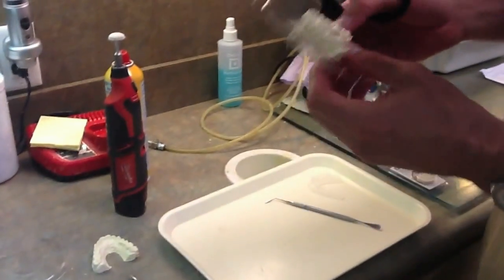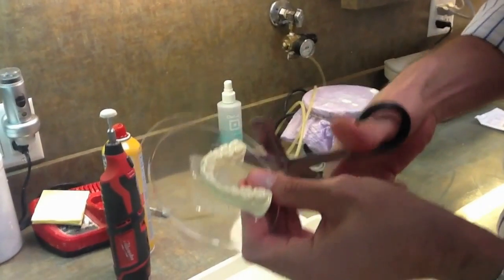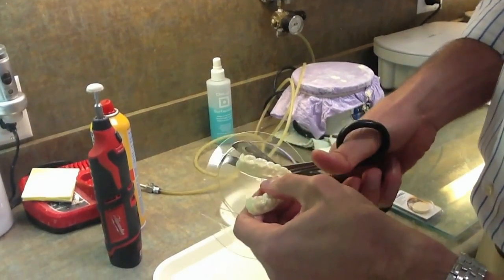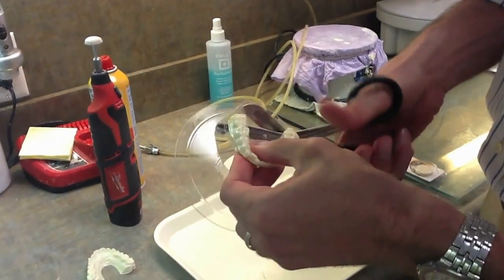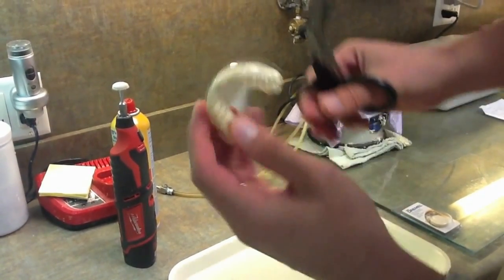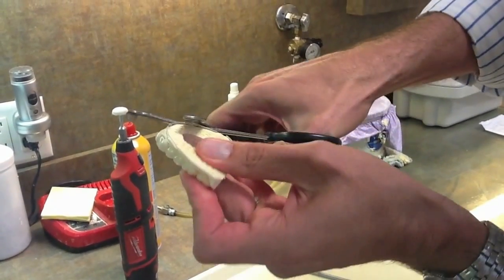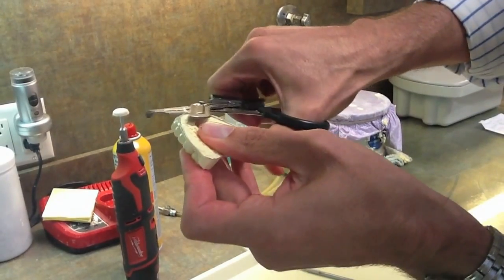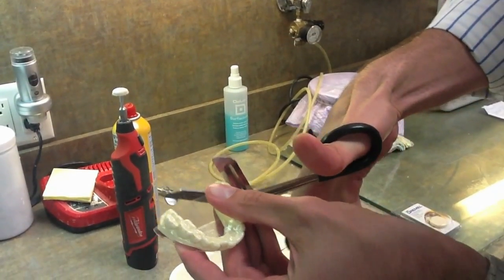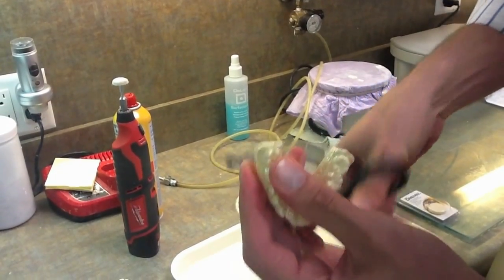Now I'm going to do a lower model to demonstrate that sometimes the tray will get blocked or sucked into an undercut. We follow the same procedure — cut around the periphery, make one vertical cut, then trim the undercut away from the model with the scissors to help unlock it. Make sure to cut off the heel portion here, as it's very important — otherwise it's extremely difficult to remove the model.